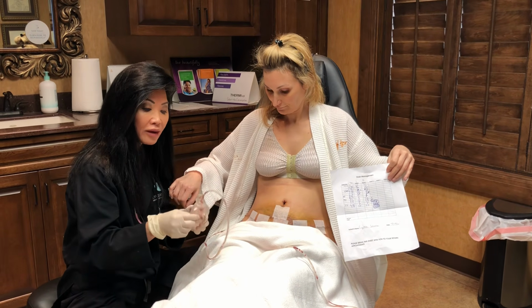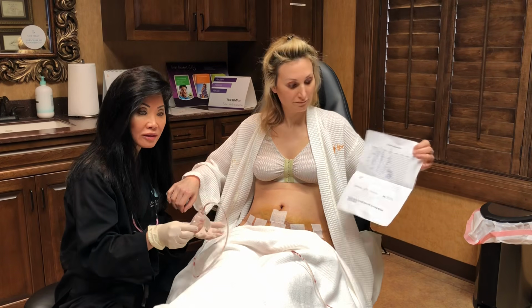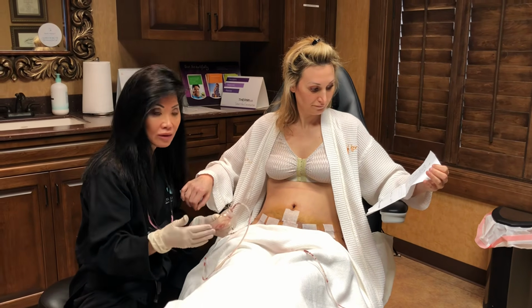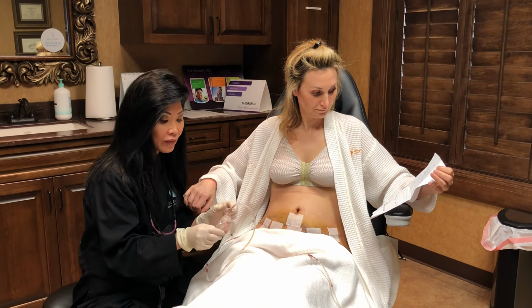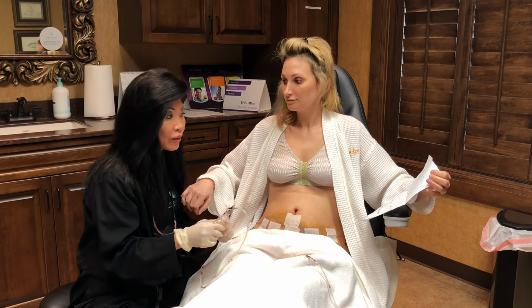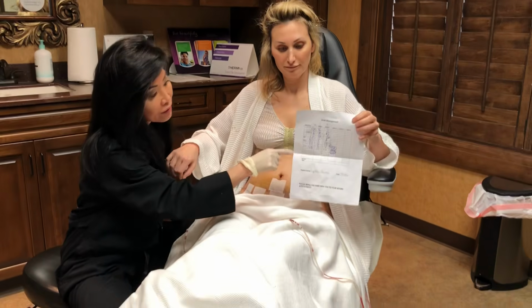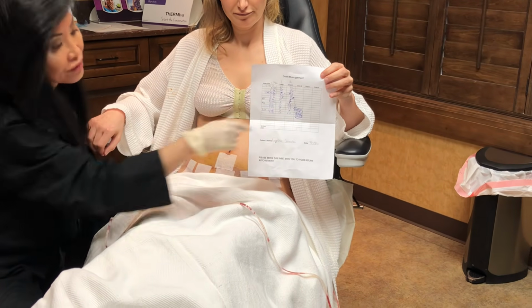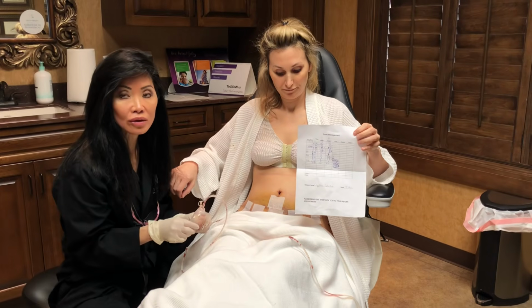And so we want the fluid to come into here. Now, you may not have very much fluid, but initially, typically you will have a lot of fluid, and then as the days go on, you'll have less and less fluid. When we're trying to record the amount, we typically will give the patient a drain sheet. It tells you the date, which drains, and how much you have whenever you're emptying it.